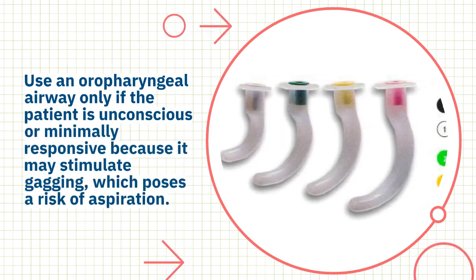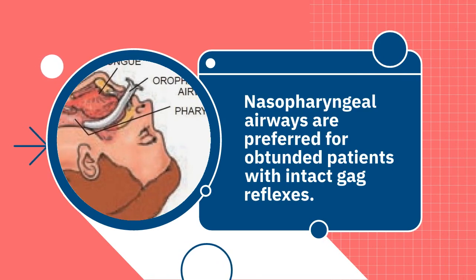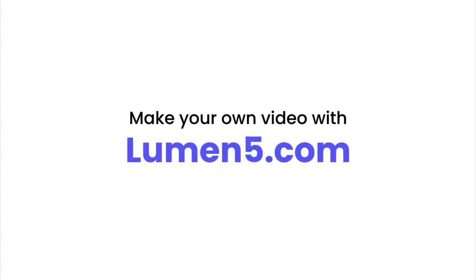Warnings and common errors for oropharyngeal airway: use an oropharyngeal airway only if the patient is unconscious or minimally responsive because it may stimulate gagging, which poses a risk of aspiration. Nasopharyngeal airways are preferred for obtunded patients with intact gag reflexes.